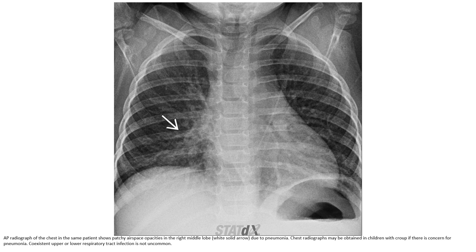AP of the chest in the same patient shows patchy opacity in the right middle lobe, due to pneumonia. A chest radiograph may be obtained in children with croup if there is concern for pneumonia, as coexistent upper and lower respiratory tract infection is not uncommon.